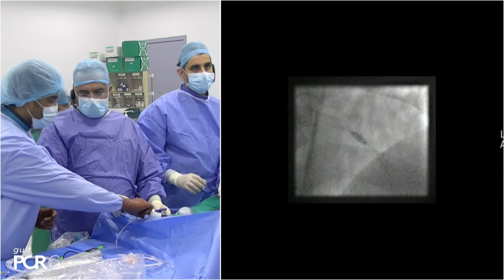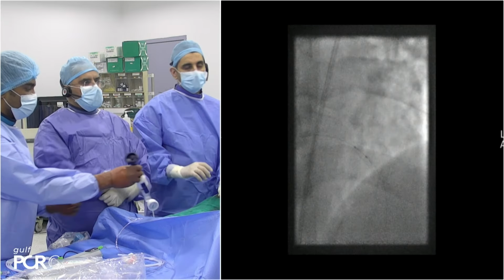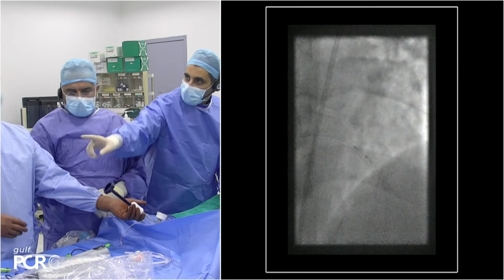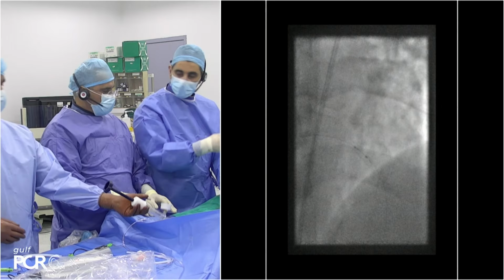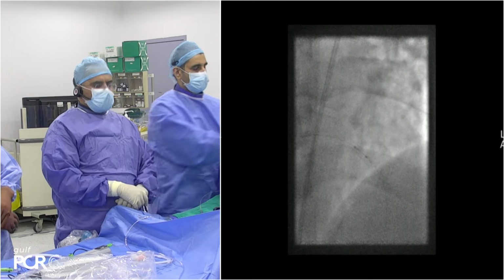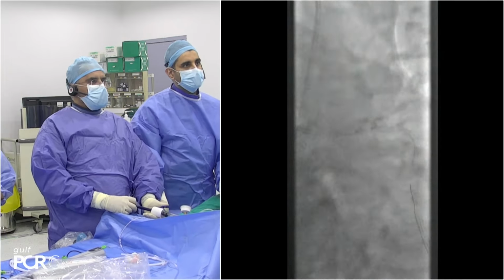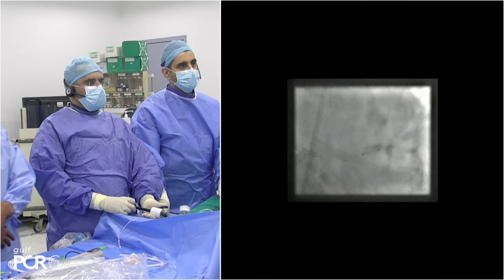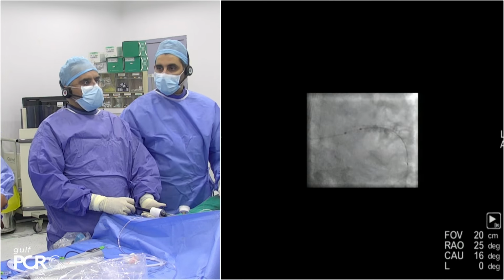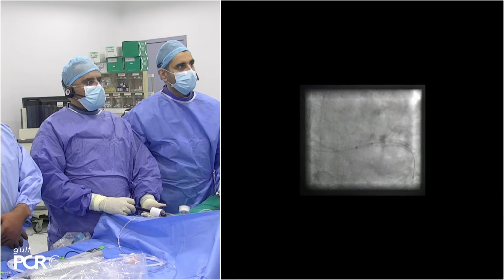Let's have a 2.5 NC balloon. But it's also dependent on the projection. Take us RAO caudal. We're going to do stent viz in RAO caudal. We'll do OCT as well. Just to Dr. Latib's point, we're going to do stent viz even in the RAO caudal, just to highlight the point he's making, which is a great point, I think. Activate, please.